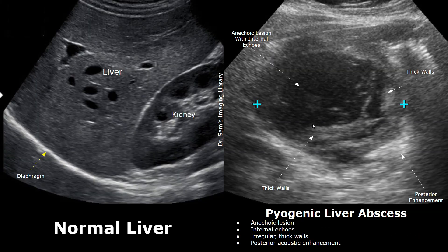This abscess appears mainly anechoic with internal echoes and septations. Some abscesses can appear mainly anechoic with echogenic thick irregular walls and internal echoes. Posterior acoustic enhancement is also present here. There was no internal vascularity on color Doppler. All these features indicate a liver abscess.